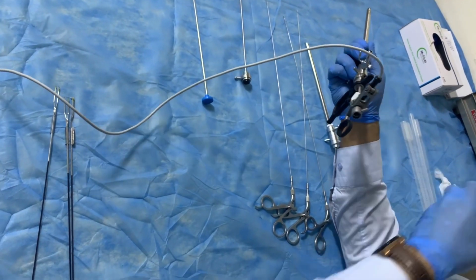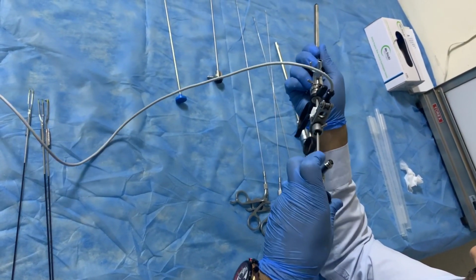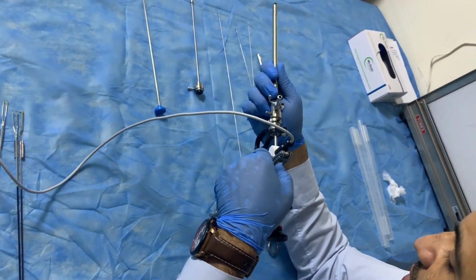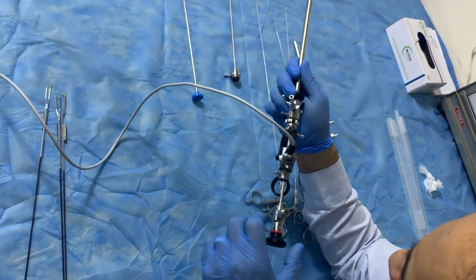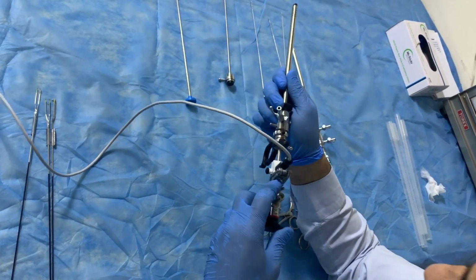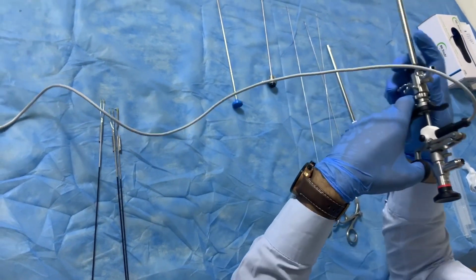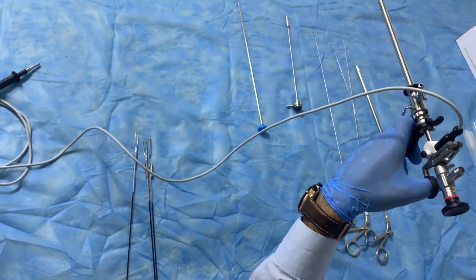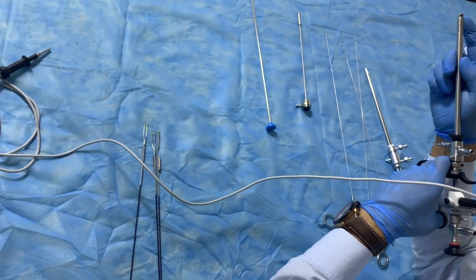And again we will pass telescope from here. Also this line should be parallel to this line. And there is notch in front of it and clockwise close. So it is ready to work now. And we looking to the monitor, suppose monitor here or monitor here, and we will do my work from here.